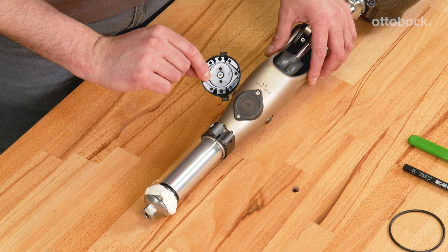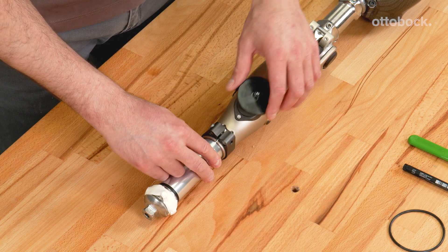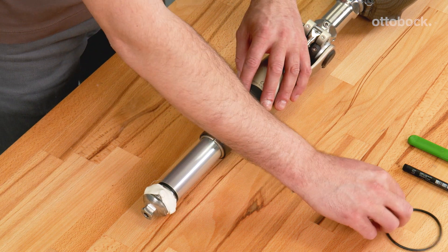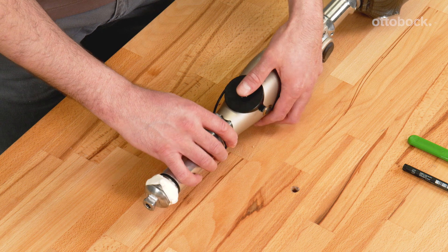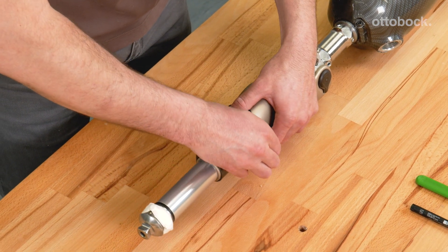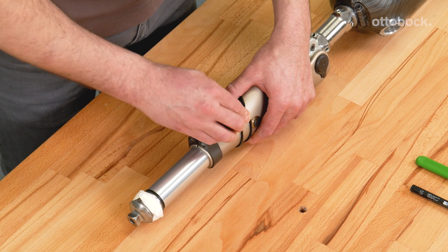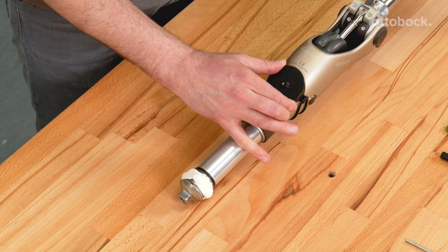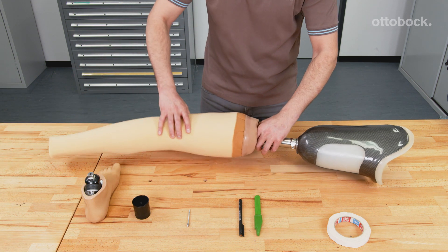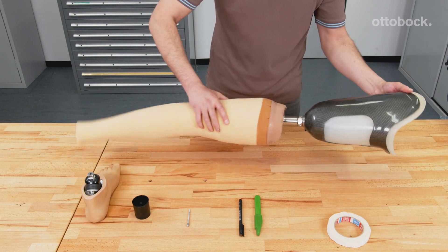Attach the centring plate to the Konevo over the receiver of the charging unit using the O-ring and assess the fit. Pull on the foam cover over the prosthesis and mount the prosthetic foot again.